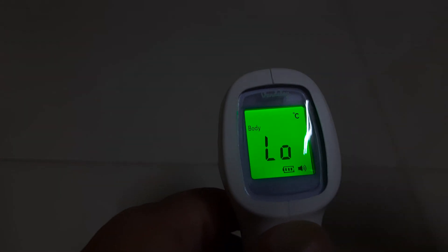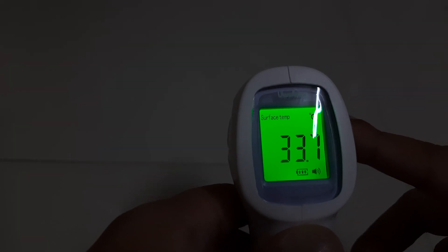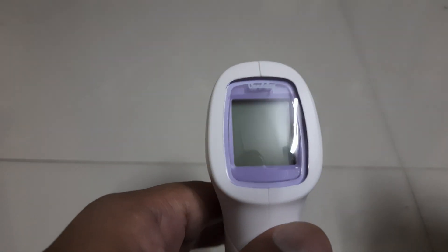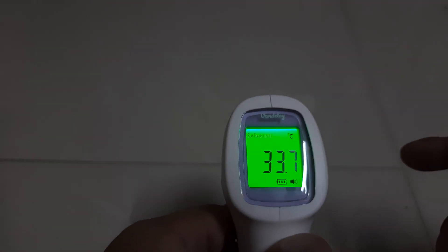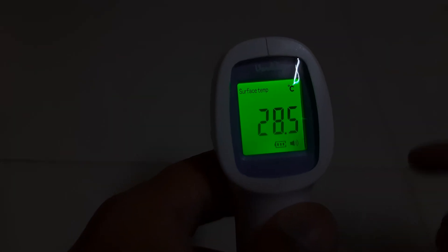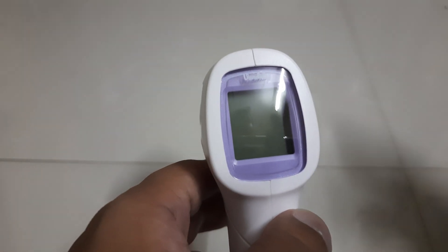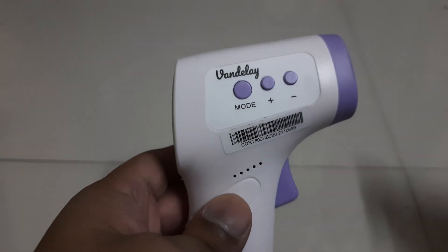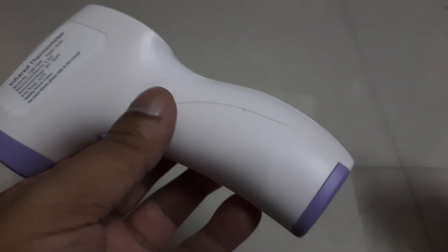One more good feature of this product: there's an option for body temperature as well as surface temperature. Let me take a surface temperature of the tiles below me. The surface temperature is reading 28.5°C right now — less than body temperature, as the tiles are cooled. So this infrared thermometer also supports surface temperature measurement.